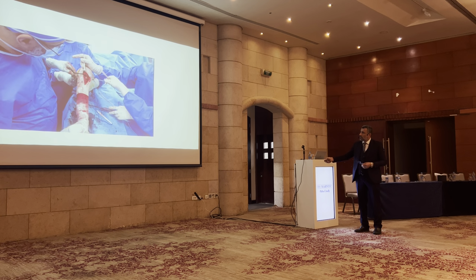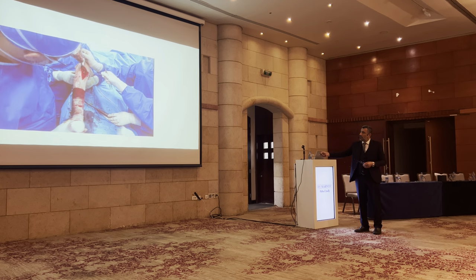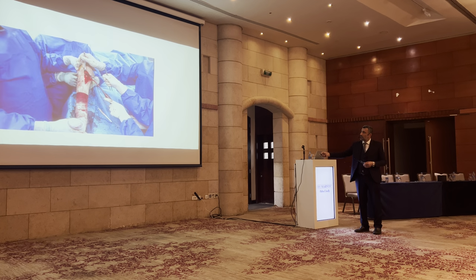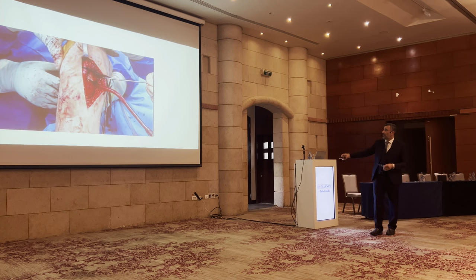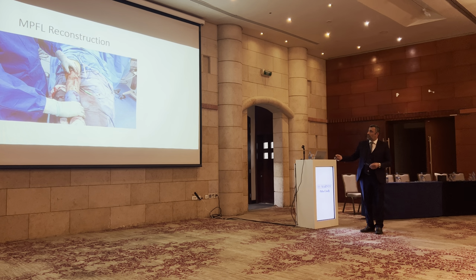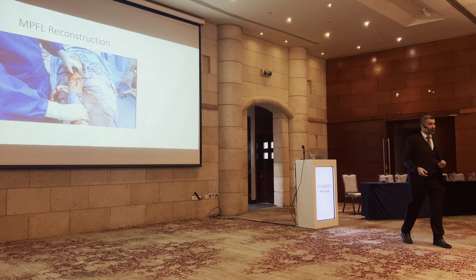Derotation. Look, now it's closing and we'll see now how it's correcting. Look to the correction, and then we applied fixation, TomoFix, and fixation. So after that, it was still unstable, so we did MPFL. This is after MPFL.